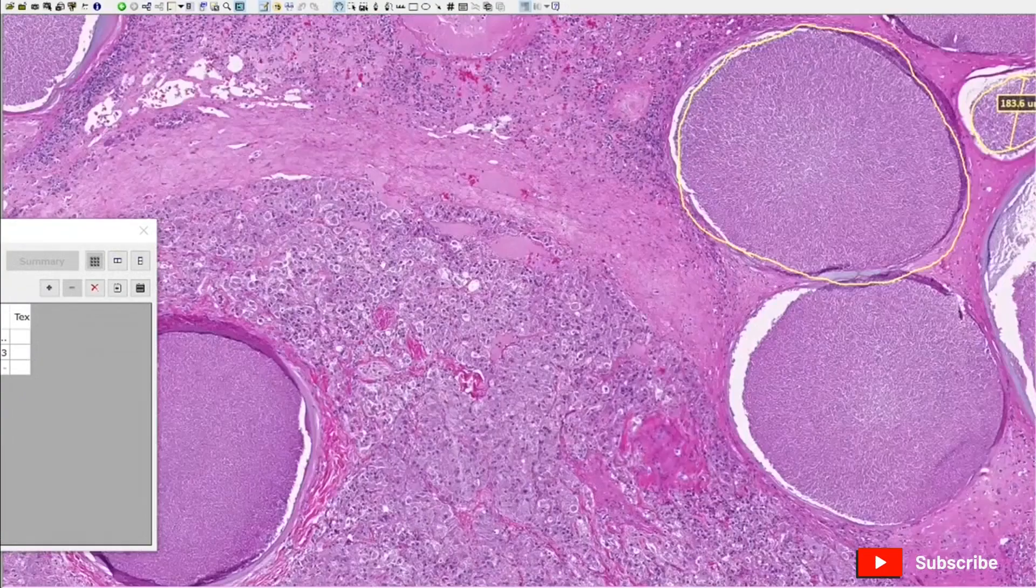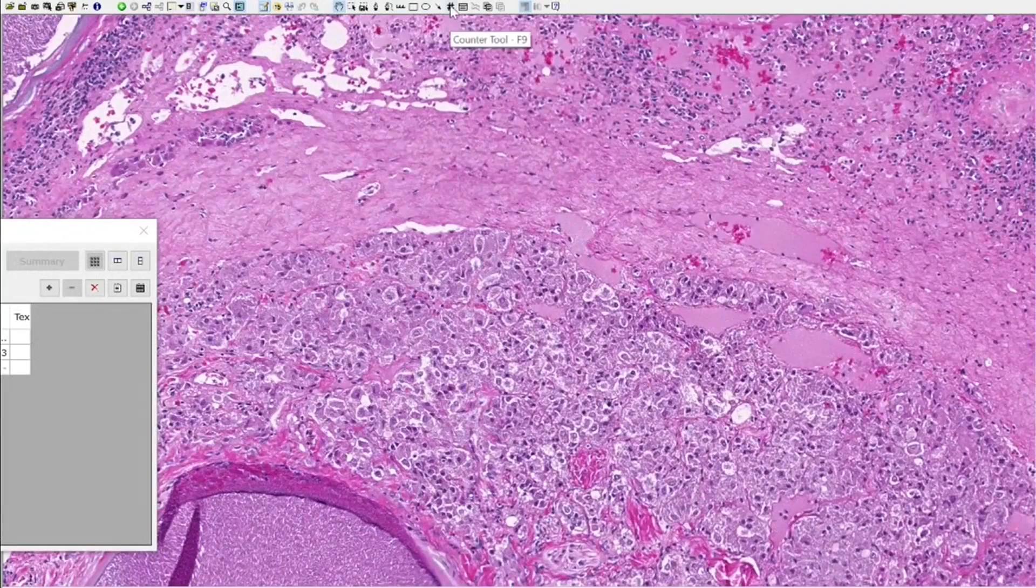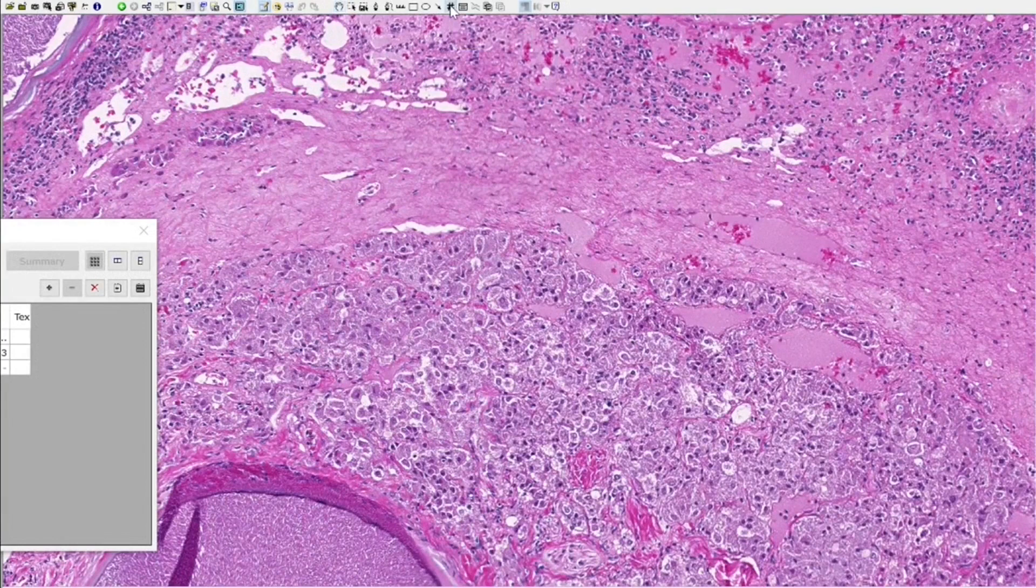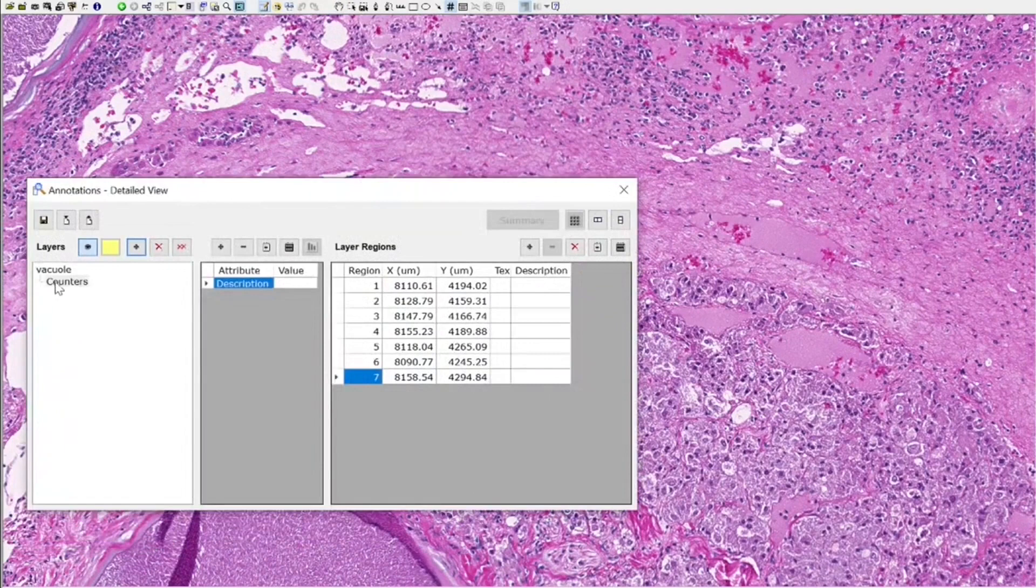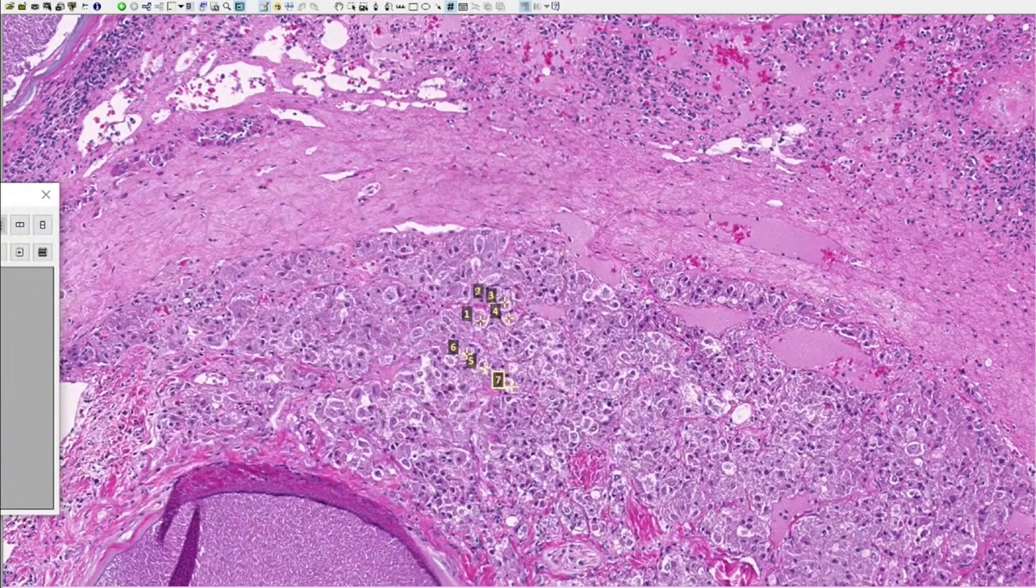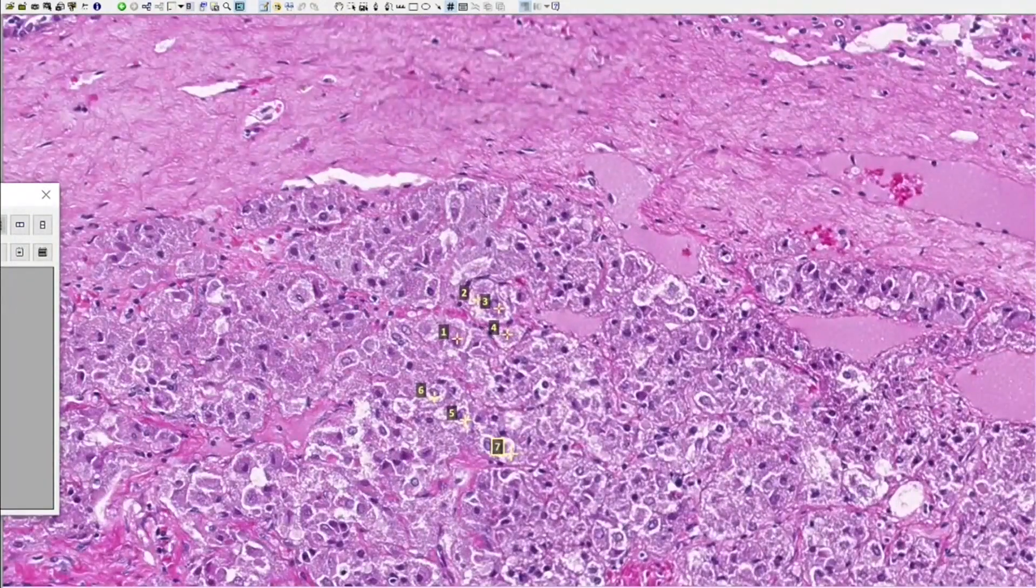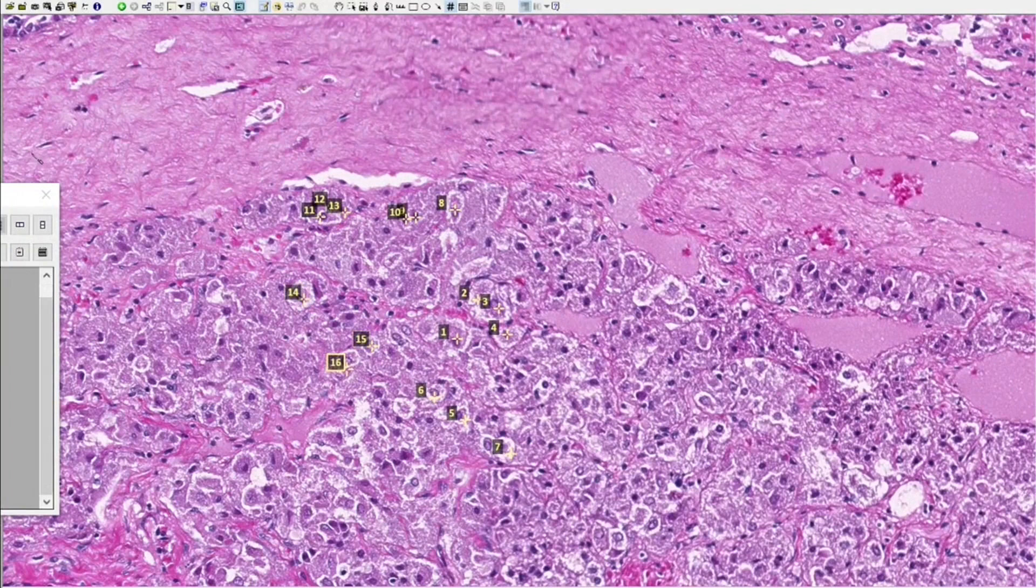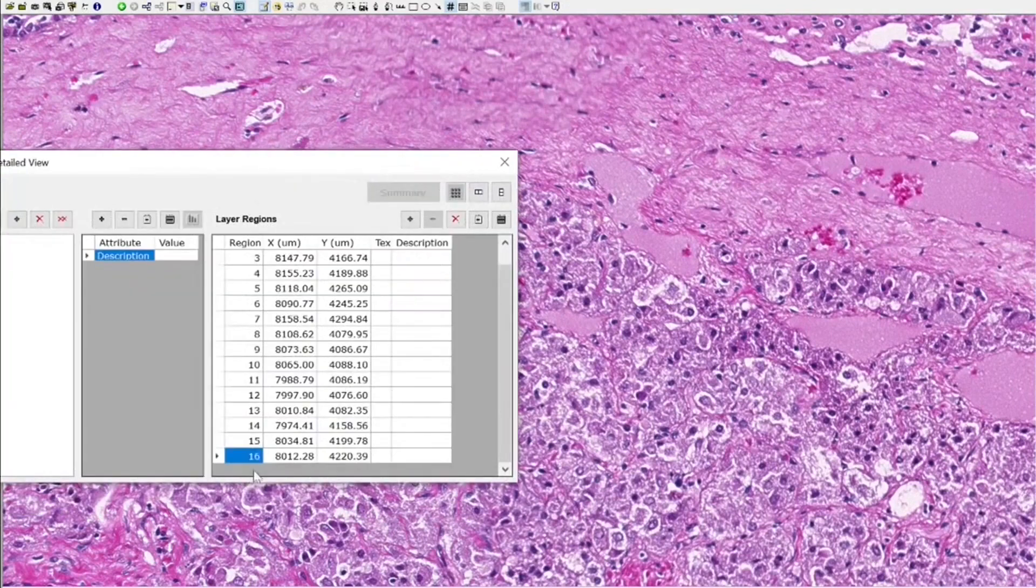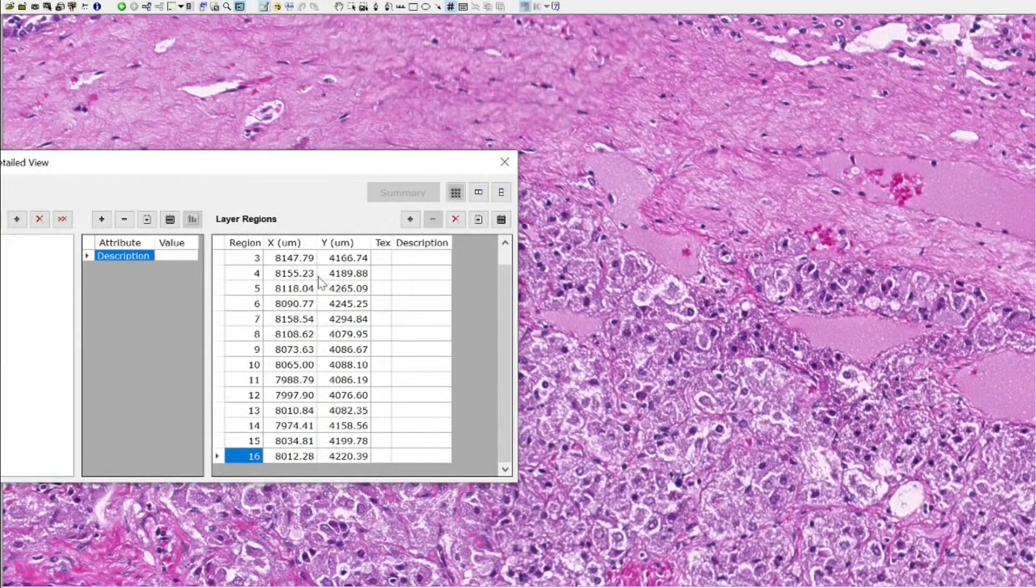I want to show you the next tool. The next tool is the cell counter, the counter tool, this hashtag here. I want to count these cells here. You can see that it's still the same class. If I want to have it in a different class, those counters, I would have to add a new class because it makes the counters within my vacuole class. But my point here is that you just click on the structures that you're seeing and you want to count, and you don't have to worry about anything else because the counter is counting this for you. You can see how many of the objects you have already counted and where are they located.